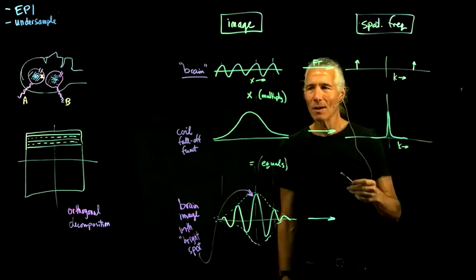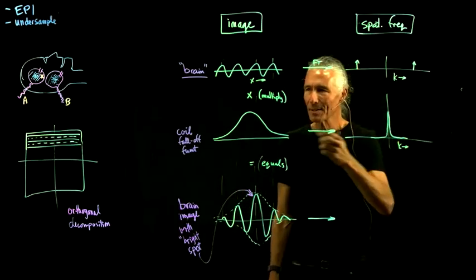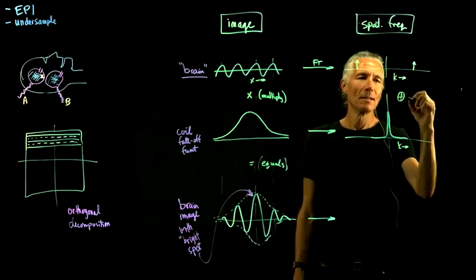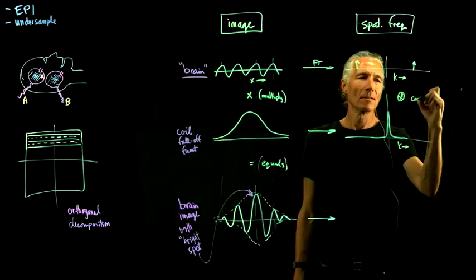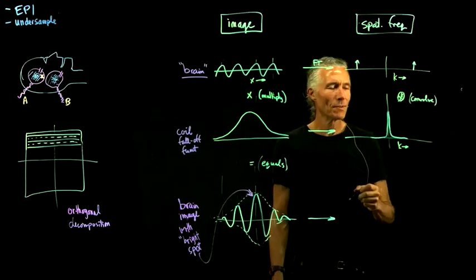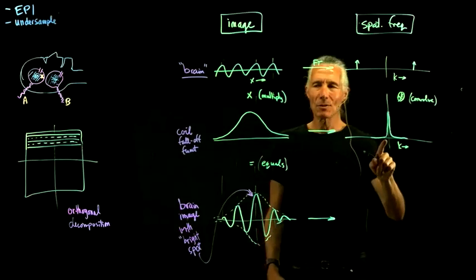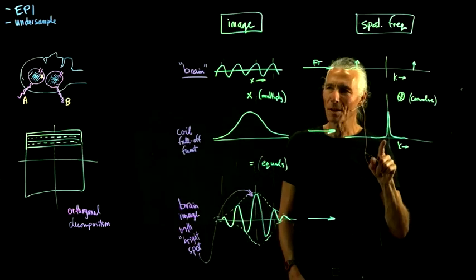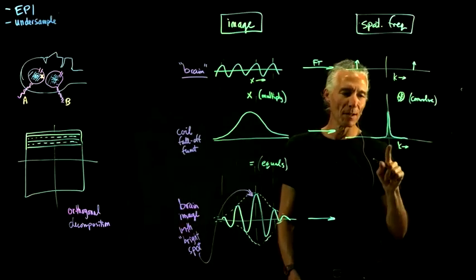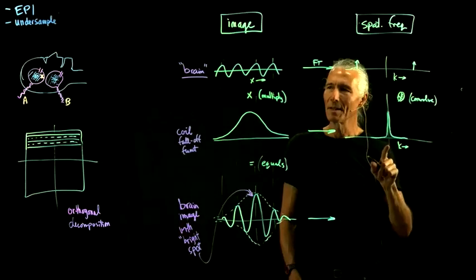And so now we're in the other domain, so instead of multiplying, we convolve. What happens when we convolve with a Gaussian? This is like your Photoshop filter. Here's your Photoshop image. It's just got 2 spikes in it, and you convolve it with a Photoshop filter that is like a narrow Gaussian. What is it going to do?